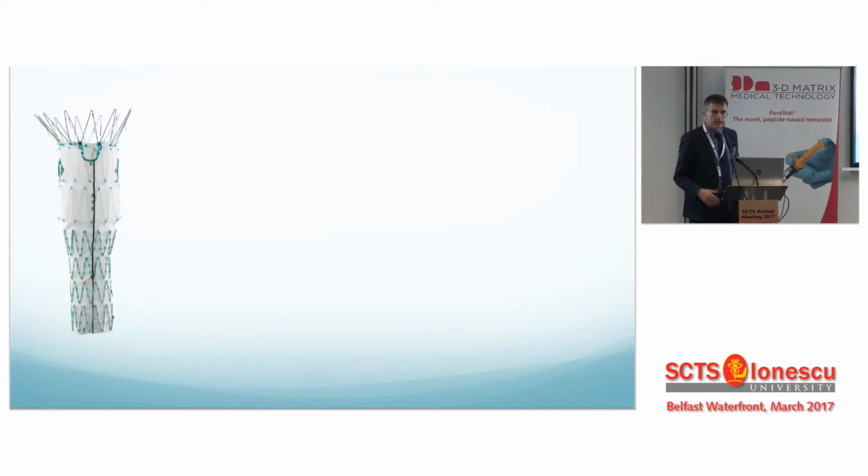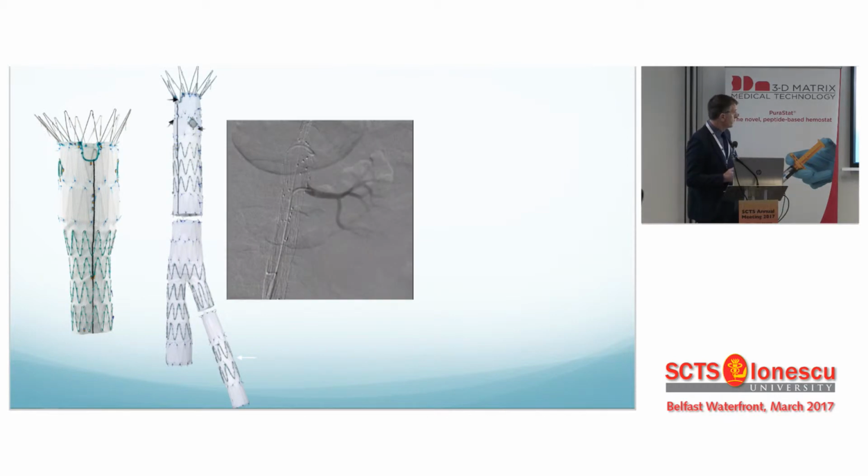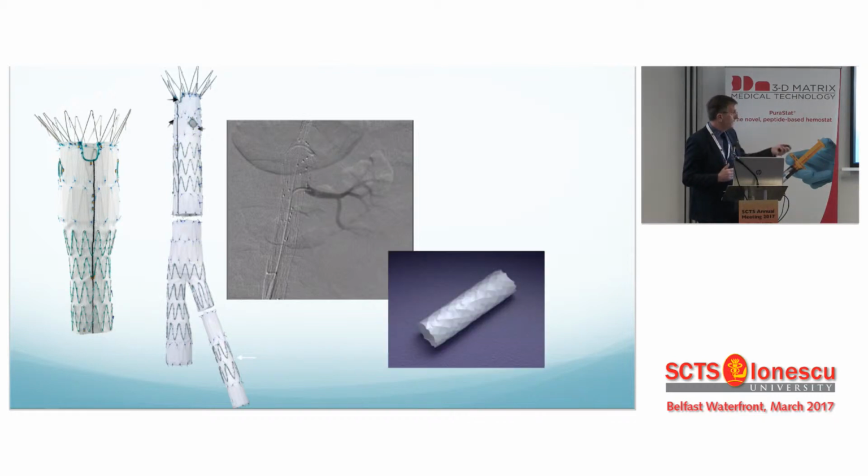You've seen this diagram before. The complex aneurysm endovascular techniques are modular devices, and for fenestrated grafting, the body section is a tubular section with various fenestrations or circles or scallops at the top. It's completed with a number of other components to make a modular system. And in this anatomy, it's where the fenestration abuts the visceral arteries and there isn't a bridge, a gap to breach. And in these we put in balloon expandable covered stents to maintain patency and effect a ring seal at the level of the fenestration.